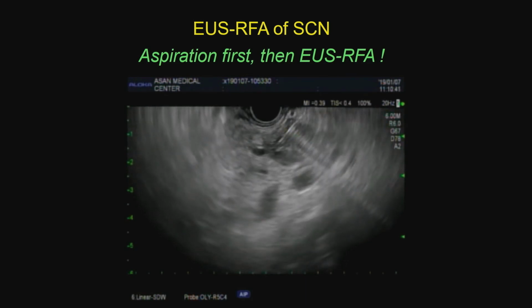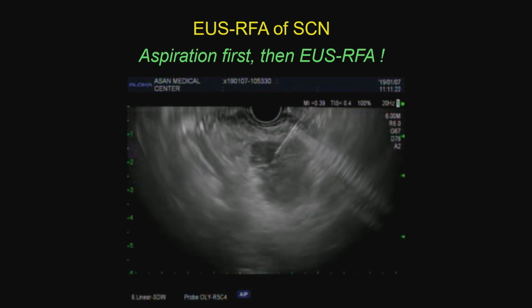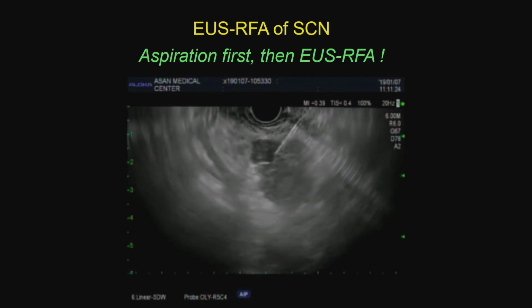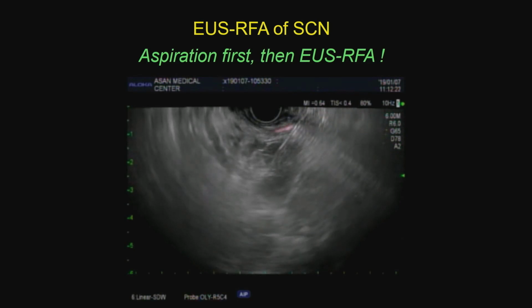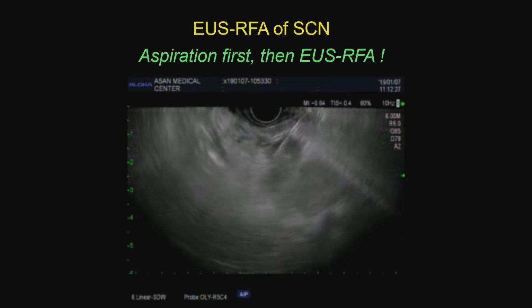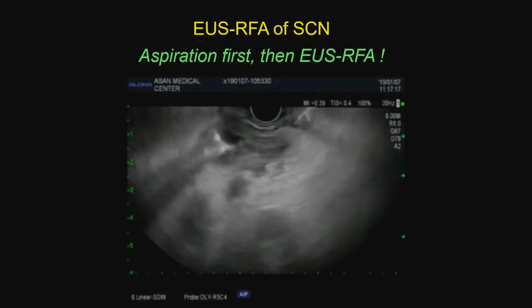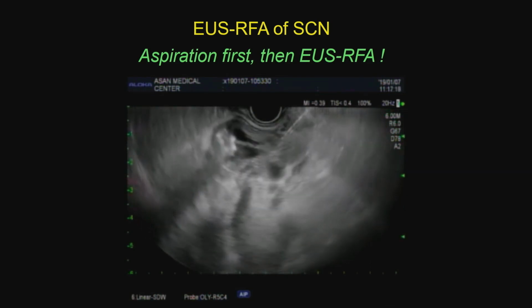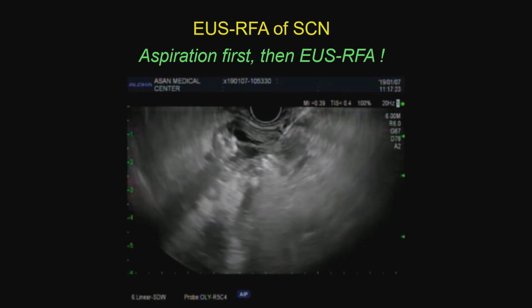Our target was crowded septum, and for this we used a 19-gauge electrode, and the active part was 1 cm. And we used 50 watts power since this is a pretty large cystic tumor. If the tumor is small, then we can modify the power into 30 watts or 20 watts. The bottom is already ablated. Now we are targeting superficial part.